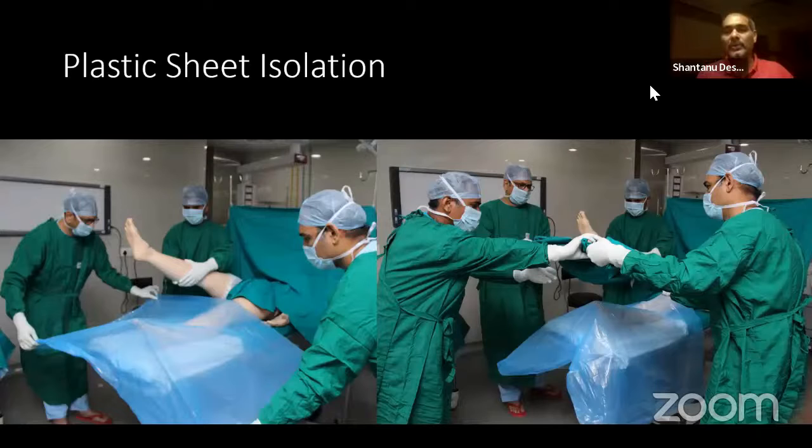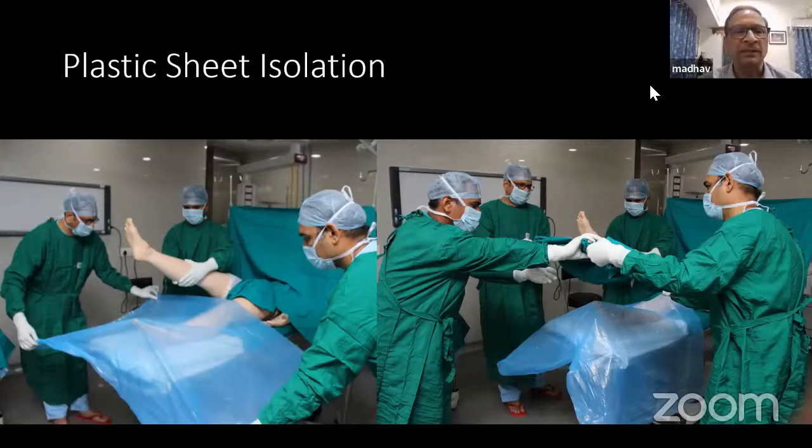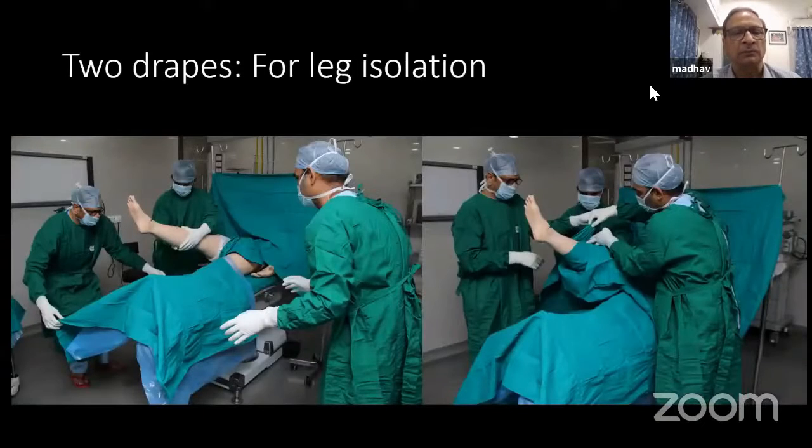Initially a few slides and then video. So basically what I'm going to describe is the draping of a lower limb surgery. The part to be operated is either below the knee — foot and ankle — or the knee and the thigh.